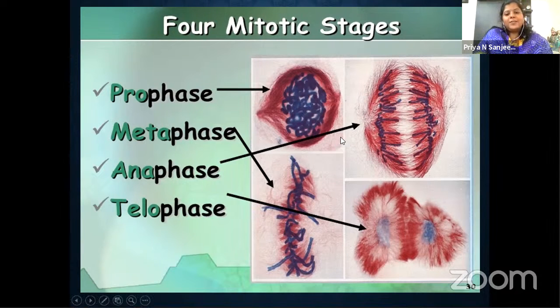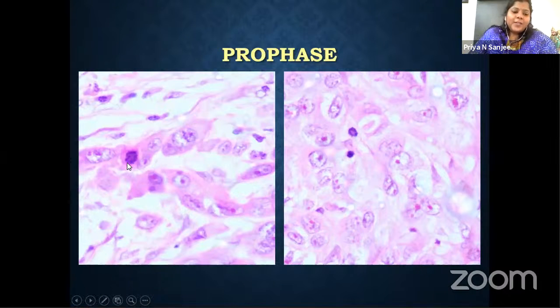So a prophase is the first phase where there is condensation of the nucleus and dissolution of the nuclear envelope. So these are the four phases. In the prophase, there is irregularity of the nucleus because of the loss of nuclear envelope. You can look at the adjacent cell where the nuclear envelope is intact. Here, the nuclear envelope is dissolved. So to call it a mitotic figure, the nuclear envelope should be lost. So this is prophase. You can see another cell with the prophase.